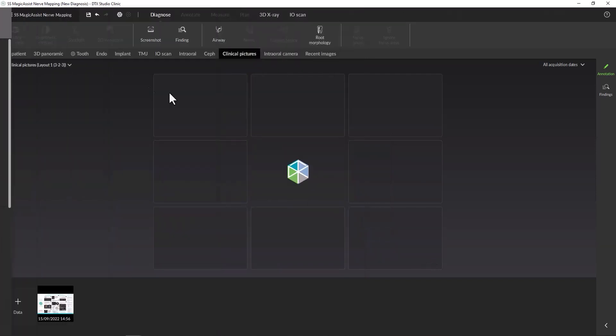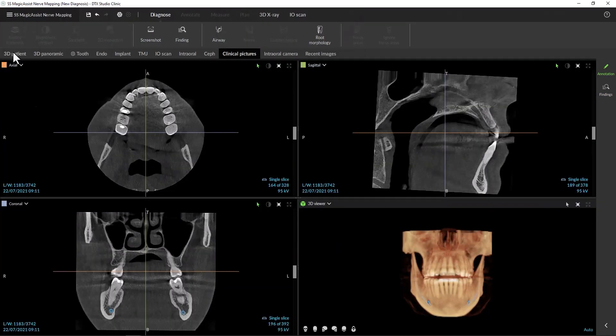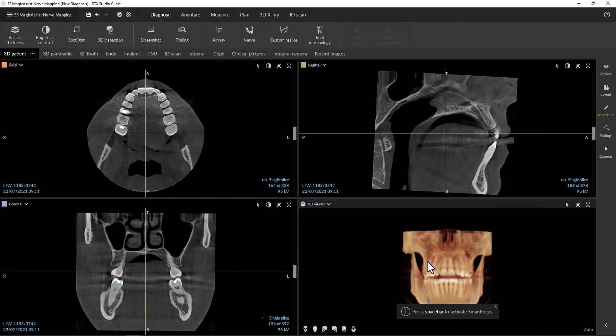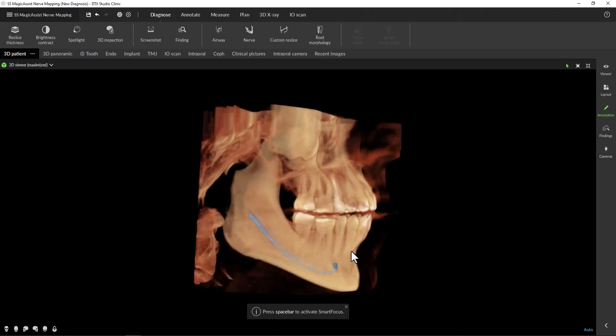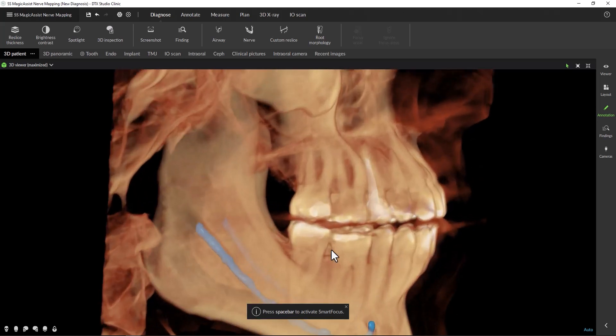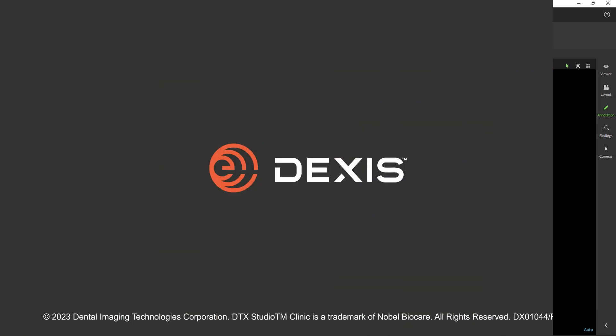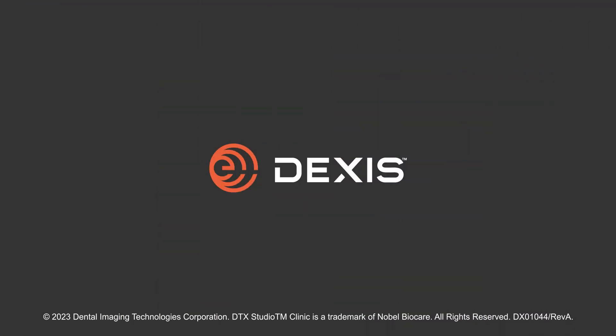Let's enlarge the volume and look at the mandibular nerves. Watch how when we manipulate the volume and zoom in, we will see that it even got the diameters correct on our nerves it marked.